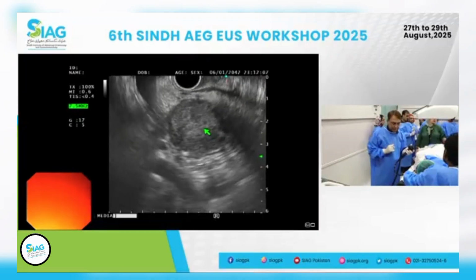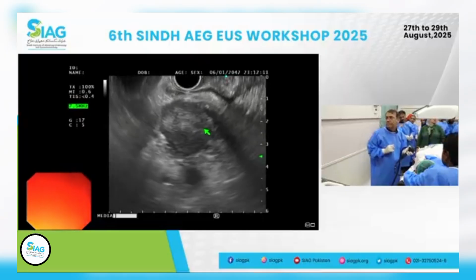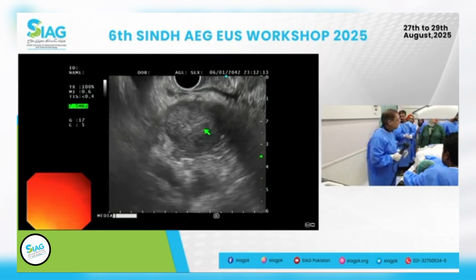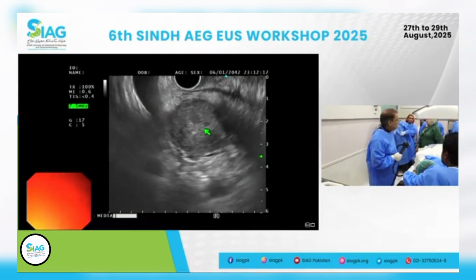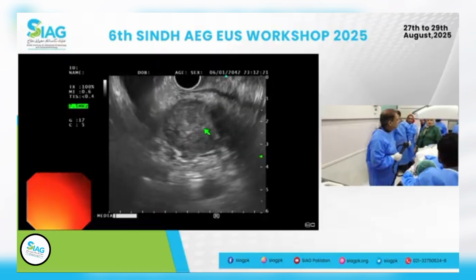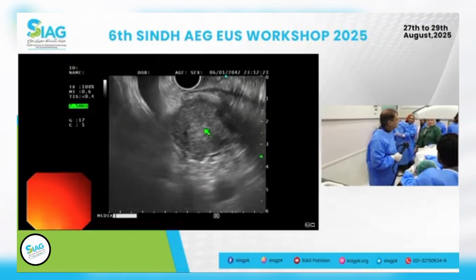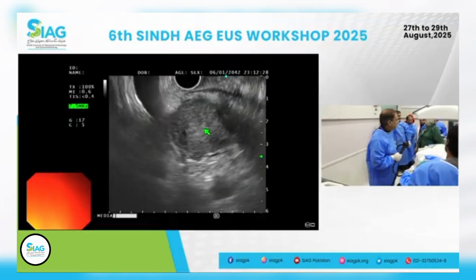So it helps if you pull back. If you feel resistance, stop, pull the needle back, push the sheath in, see if it comes out nicely, keep it out a little bit, and then actually insert the needle. Scope damage can occur because of the needle puncturing the sheath.